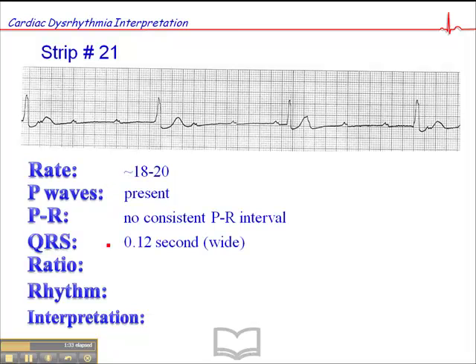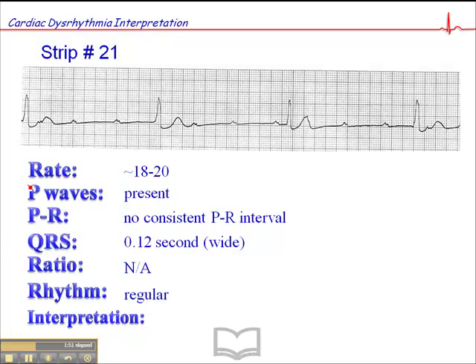We have a wide QRS — about 0.12 seconds. Given the fact that there's no consistent PR interval and we have a wide QRS, that certainly raises the question of whether these P-waves are dissociated from the QRSs. The ratio is not applicable, and the rhythm is regular, which suggests that the wide QRS is coming from a single focus.